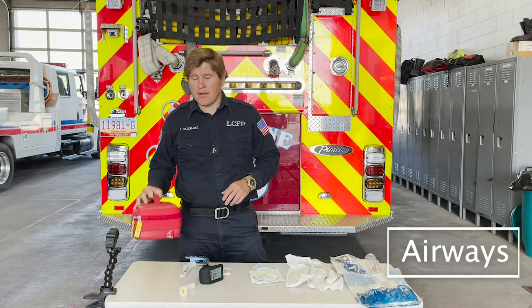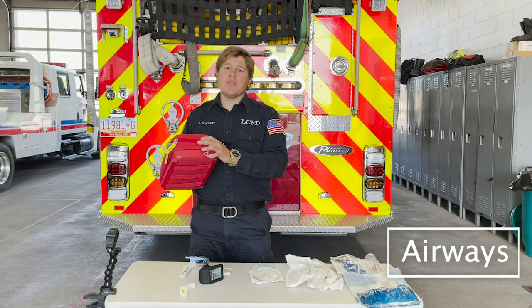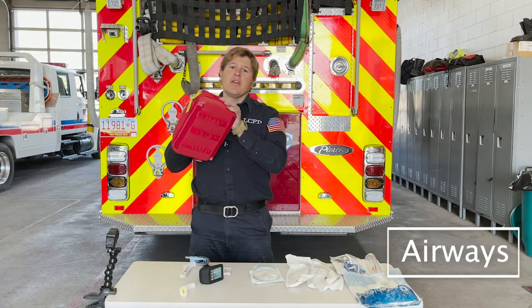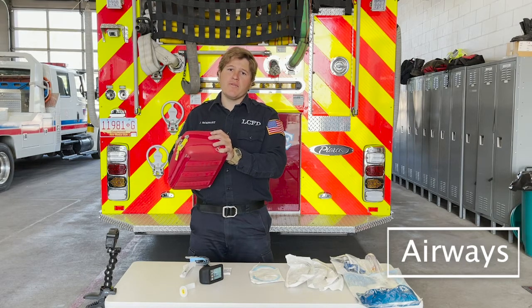That includes getting backups. I have my preference on which blade I would choose as a backup, but take your backup out, place it onto the handle, make sure the light works, and set it next to you somewhere so you can grab it in case something goes wrong with the video laryngoscope.